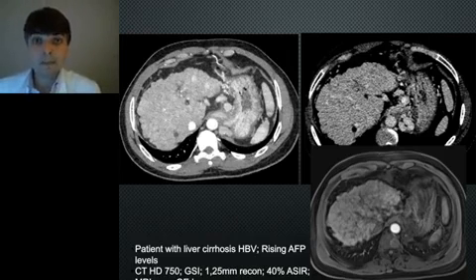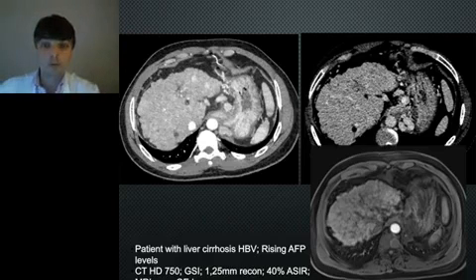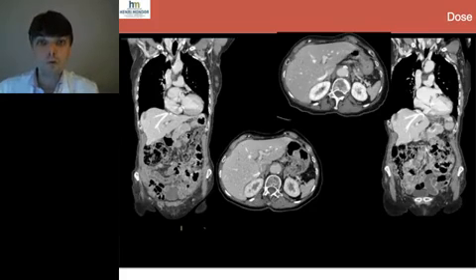Okay, but there must be some drawback. Yes, there are some drawbacks and there are some questions. First issue is a question of dose. What do we lose in terms of dose exposition in those patients? Well, there is a price to pay in there.